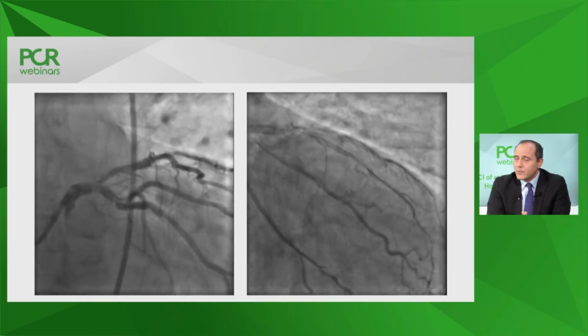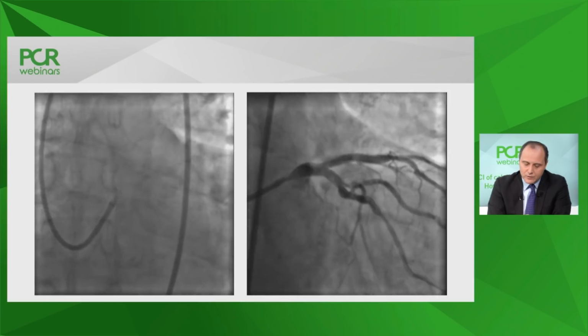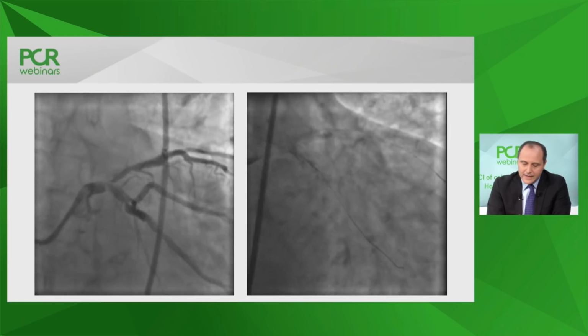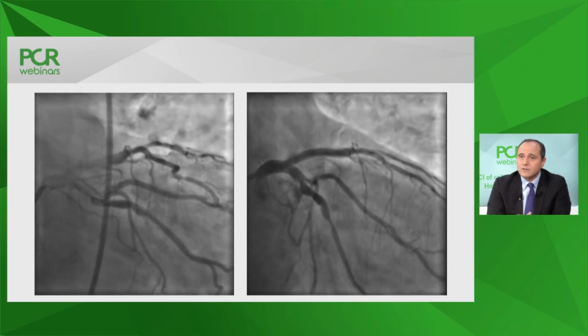So we dealt with an elderly patient, very complex case, challenging bifurcation lesion of the left main and a sequential bifurcation lesion of the proximal circumflex. We discussed here the need for hemodynamic support in this case, and we agreed that there was no real indication to have an elective hemodynamic support to start with. We also highlighted the importance of having imaging-guided PCI. And we discussed about rotablation technique, how to properly perform rotablation technique and plaque modification. We ended up with 2 stenting strategy, and we took very wise decision not to overdo and accept a very good result, even if there was some indentation of the stent.